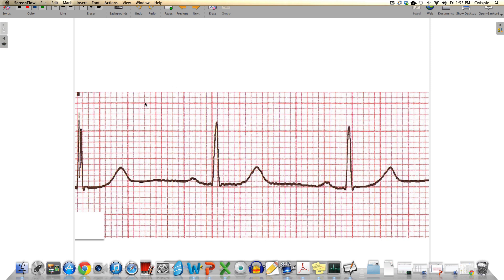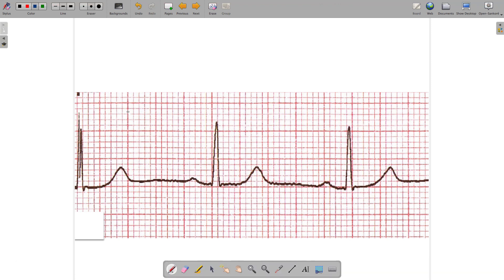Let's take a look at the graph paper. It's comprised of some very dark pink gridlines and some lighter pink gridlines in between. Each big box created by the dark pink gridlines measures exactly 5 millimeters by 5 millimeters — 5 millimeters tall and 5 millimeters wide. This box represents a specific time interval along the x-axis, which refers to time.